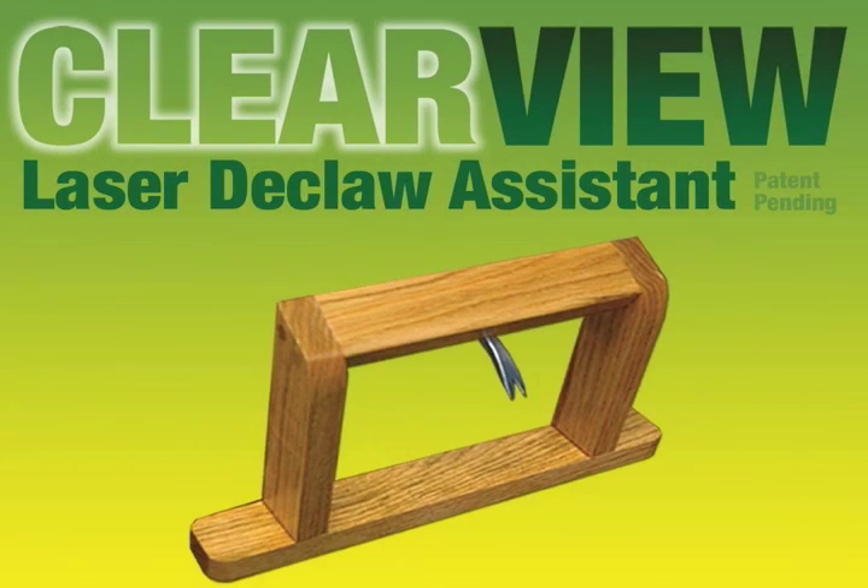Introducing the ClearView Laser Declaw Assistant. This device clears the skin and hair out of the way for a clear view of the surgical site while stabilizing the paw. The solid oak frame is practical, durable, and waterproof — it simply wipes clean with no maintenance or sharpening ever needed. The frame clamps to the surgical table and holds the stainless steel guide, which can be easily detached for cleaning and sterilization.